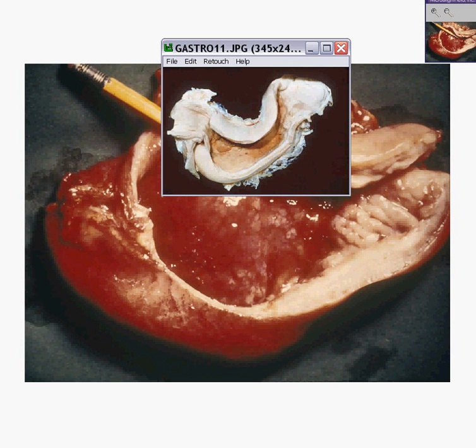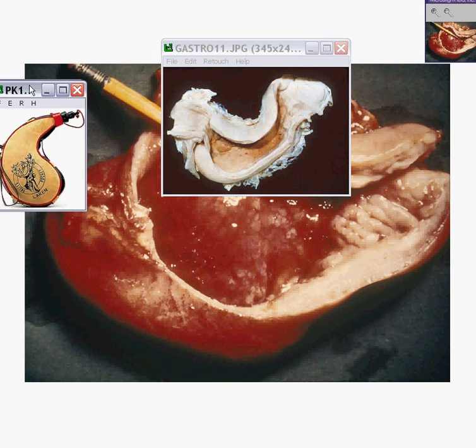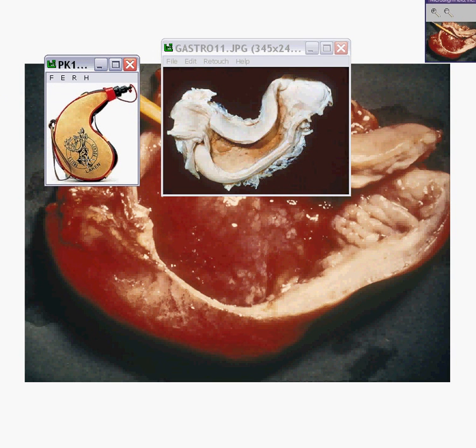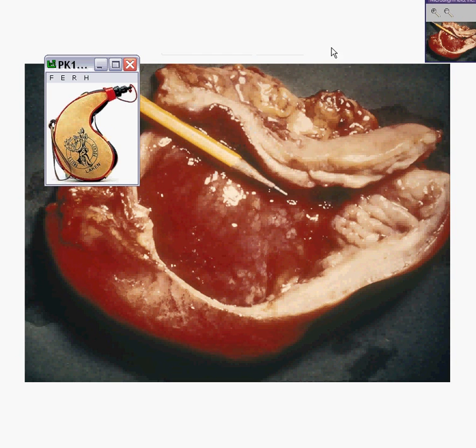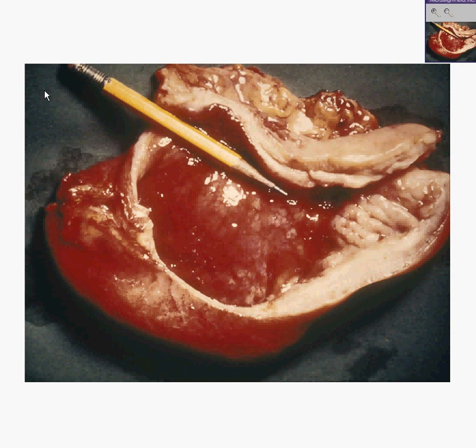Here's an actual leather bottle showing why linitis plasticas are called that. The tumor is diffuse and so poorly differentiated that it just diffusely thickens the entire wall of the stomach. Sometimes there's not even much of a lumen left.